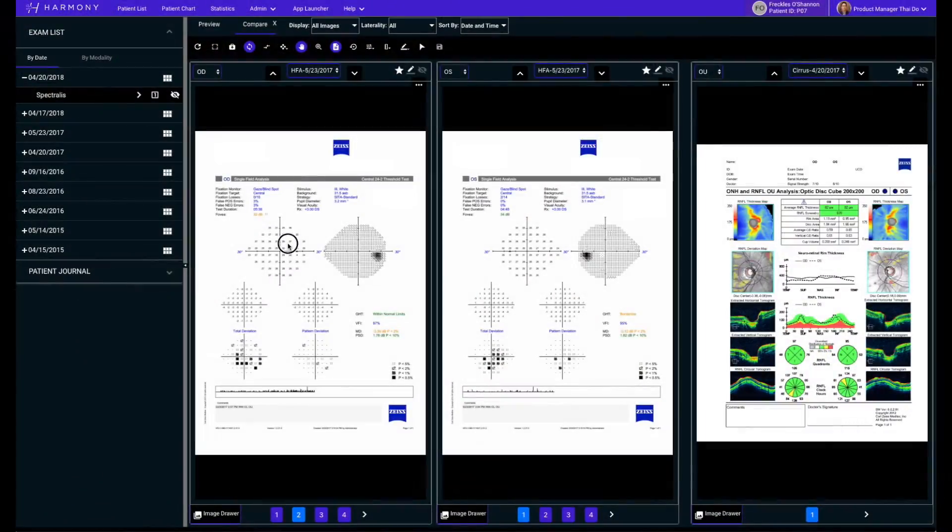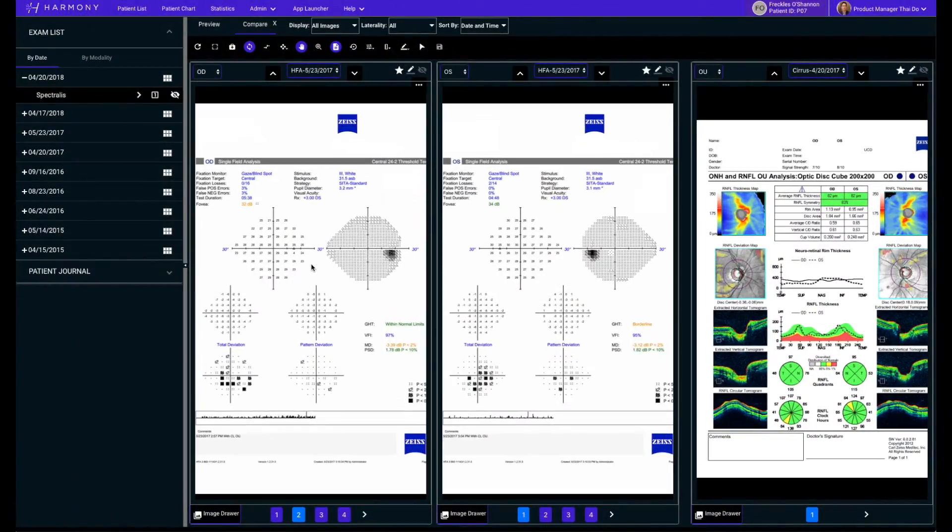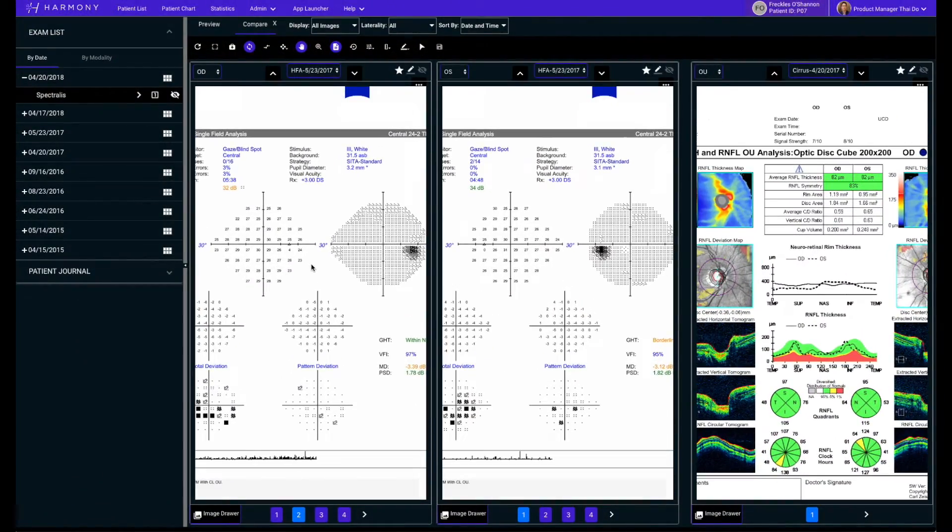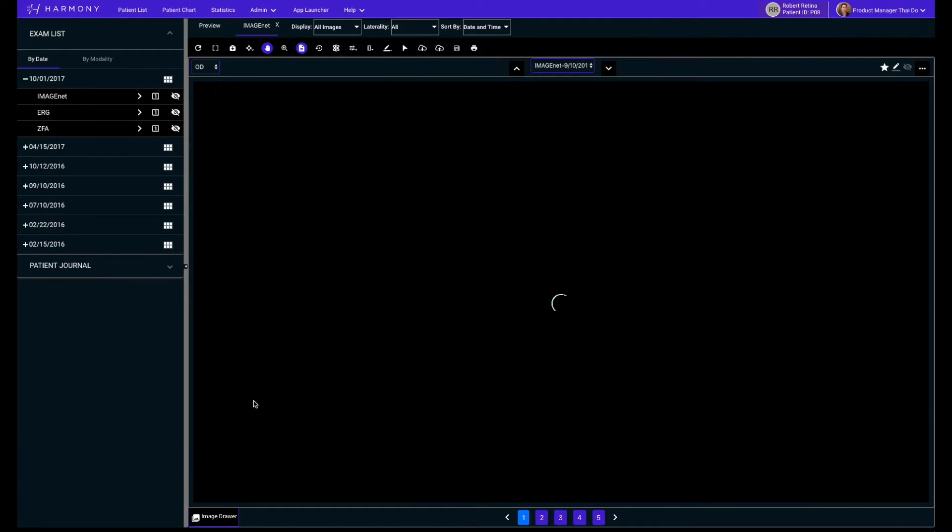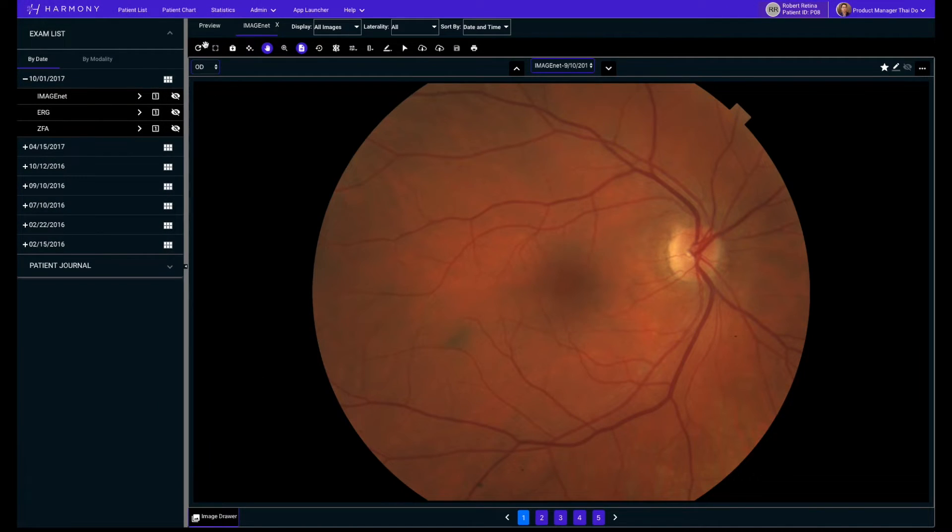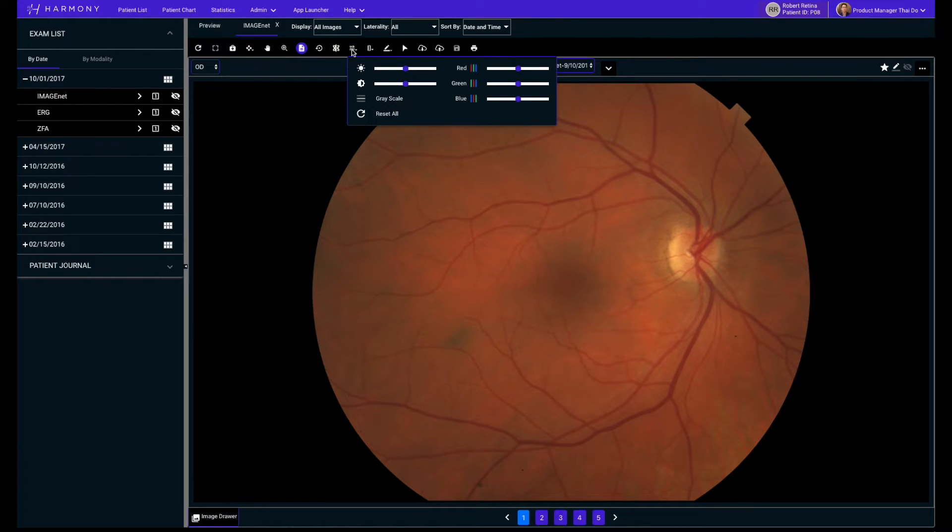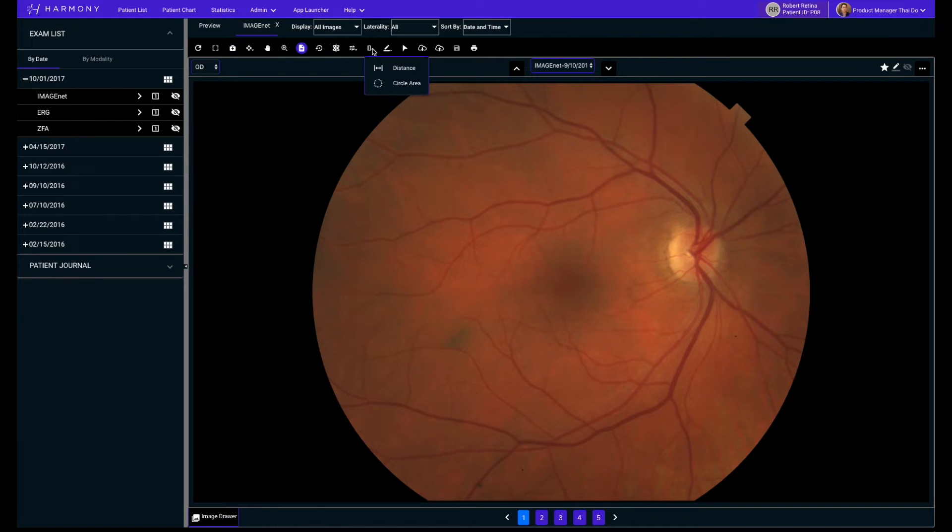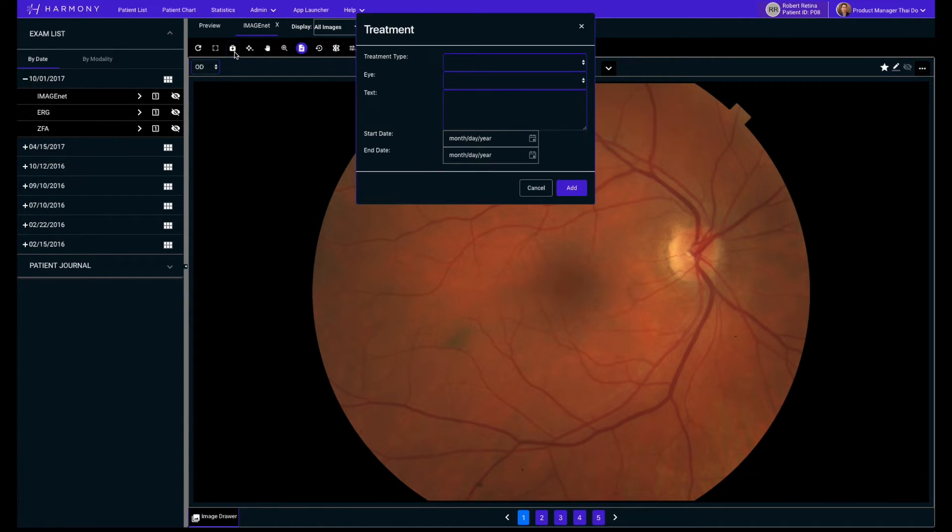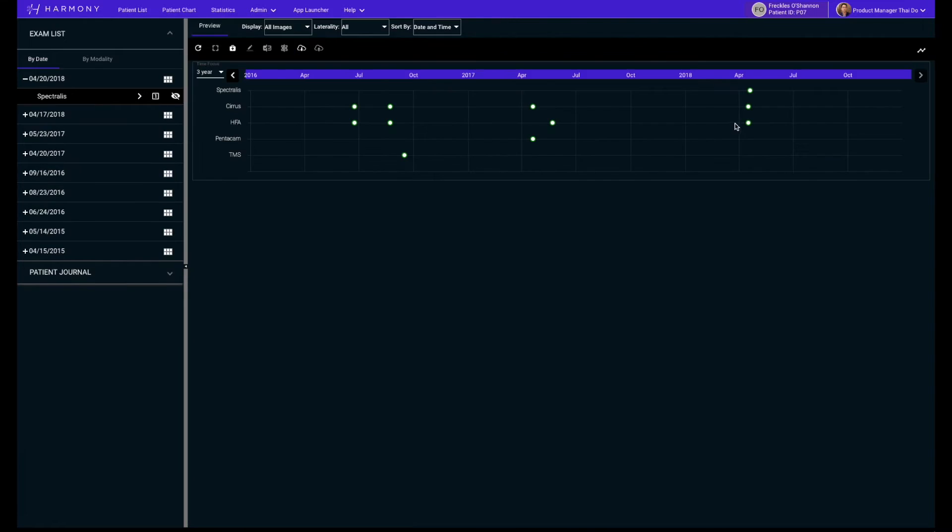You can even select images from any modality for comparison. Across the top you will find a variety of image manipulation tools like annotations, color filtering, brightness and contrast enhancements, and measurements. You can even input treatment notes.